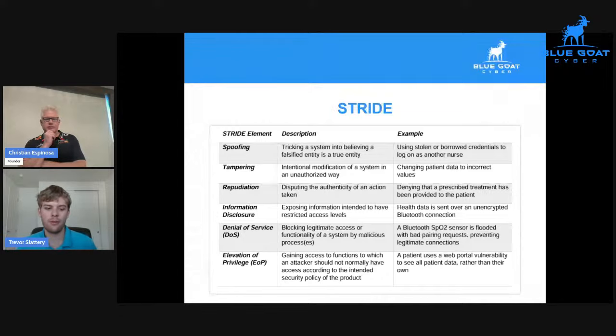And that tampering is a big concern for medical devices, because we could tamper with the data, with an in vitro diagnostic system, and cause it to give out a false analysis of a result, really, right? Exactly. And so that's usually going to be one of the big concerns. Often traditional cybersecurity is broken into confidentiality, integrity, availability.